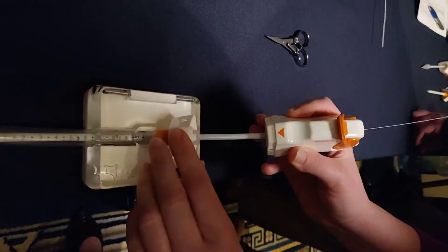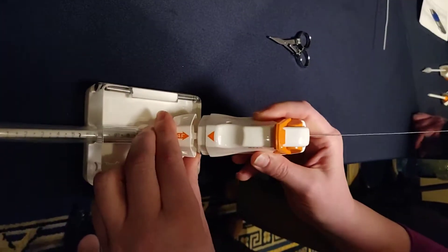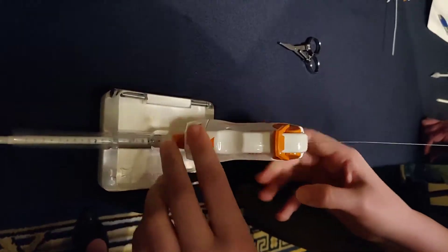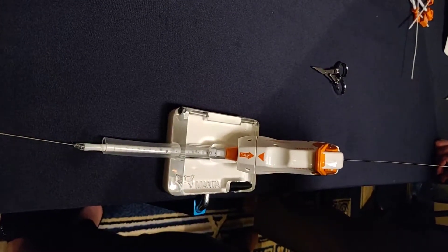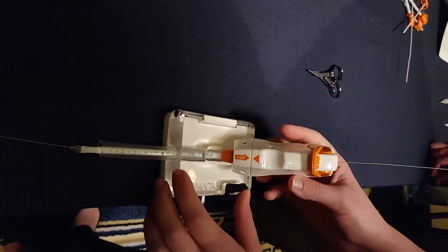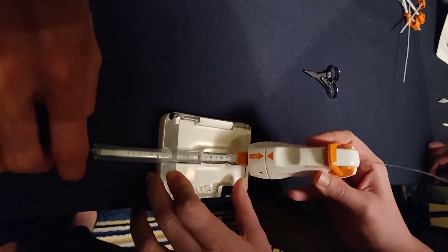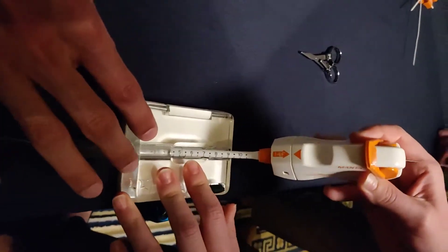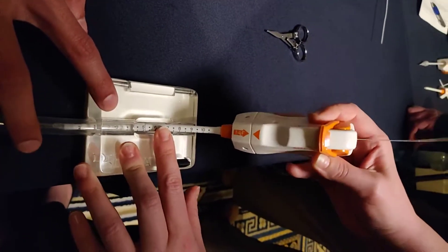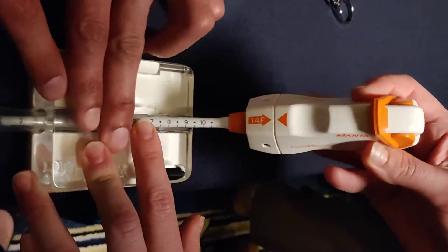All right, so then we go arrow to arrow. You're gonna either hear one big click or two little clicks. Okay, there's one big click.